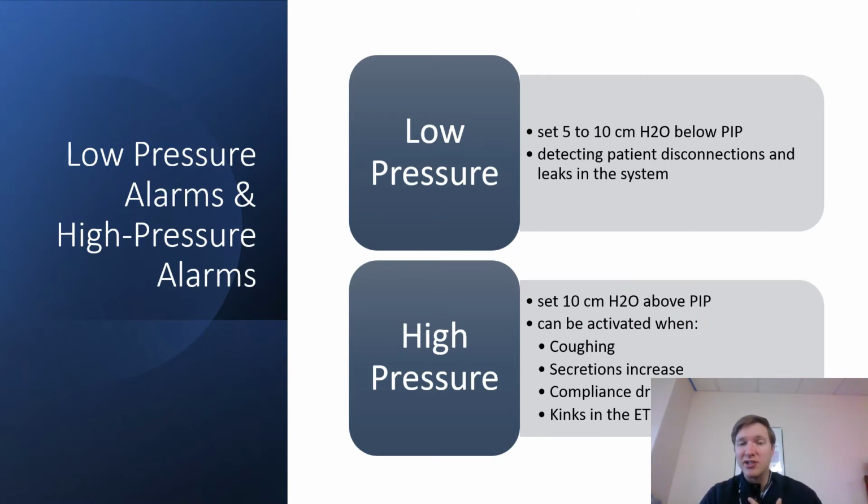So during that procedure, something that we would do traditionally is try to take the high pressure alarm up really high, so that way the patient still gets breath delivery during that procedure. So like I said, always make sure you turn it back down afterwards, of course, but make sure you always follow your hospital's policy and procedures. It's there for safety, it's there for a reason, but that is sort of a caveat to that high pressure thing, is when we're doing that type of a procedure where we might have to take the high pressure alarm up high to allow for adequate ventilation during that procedure.